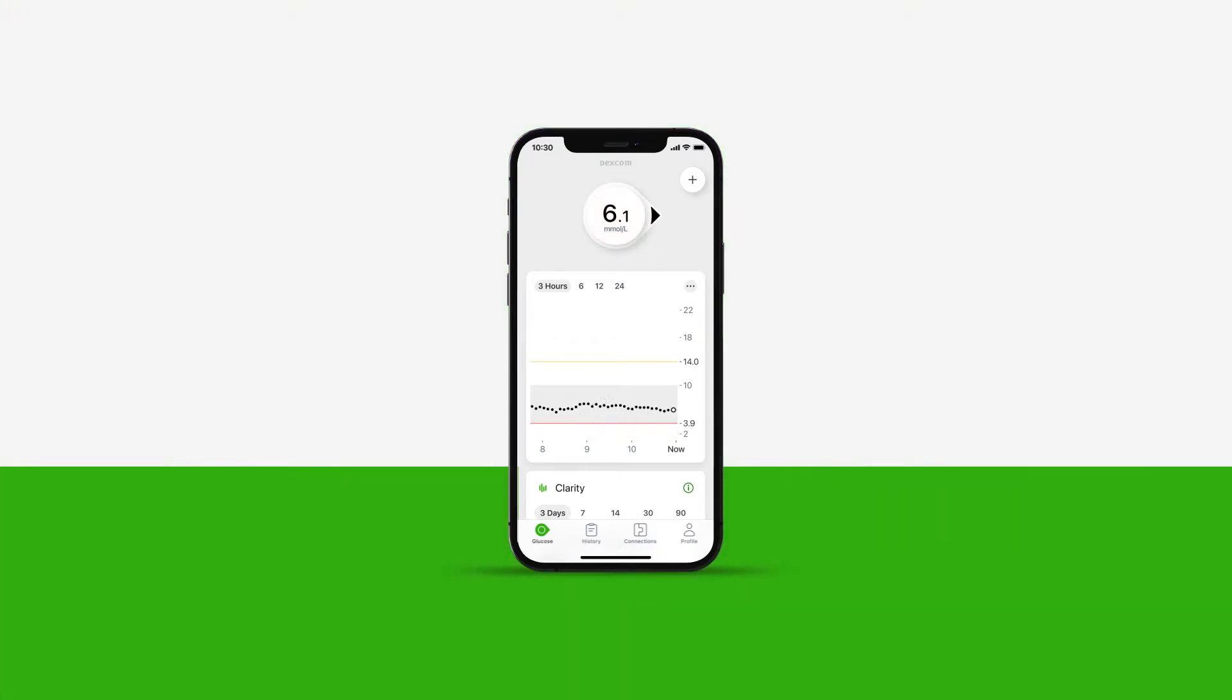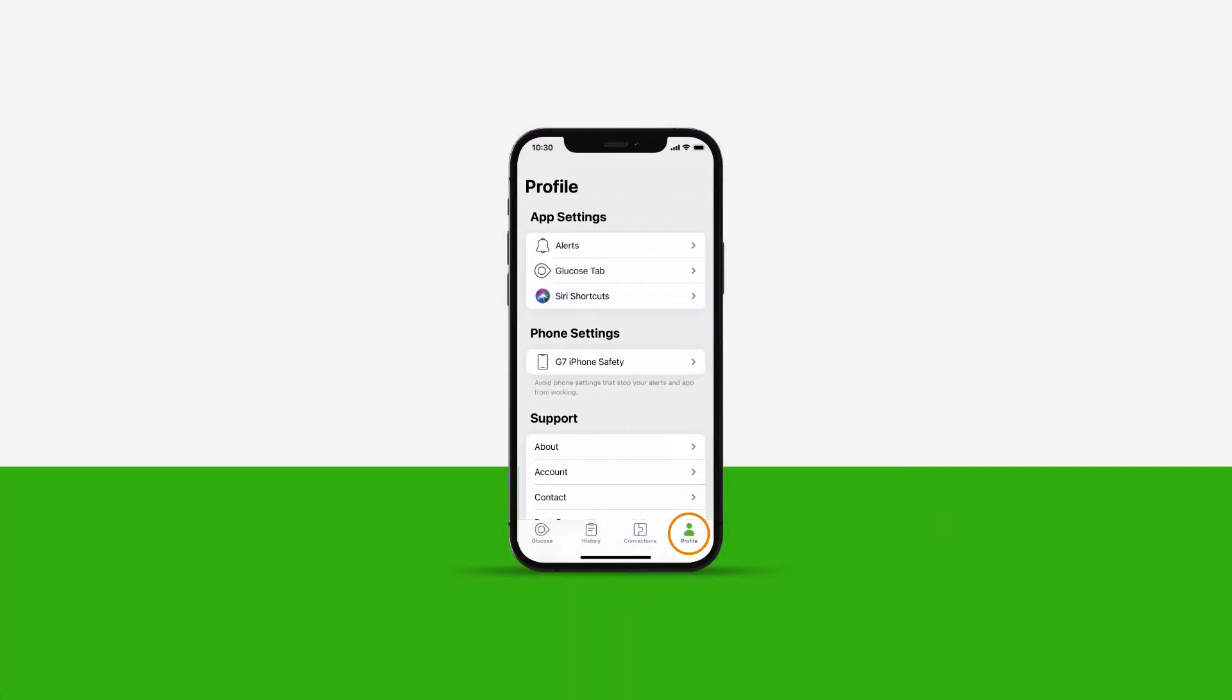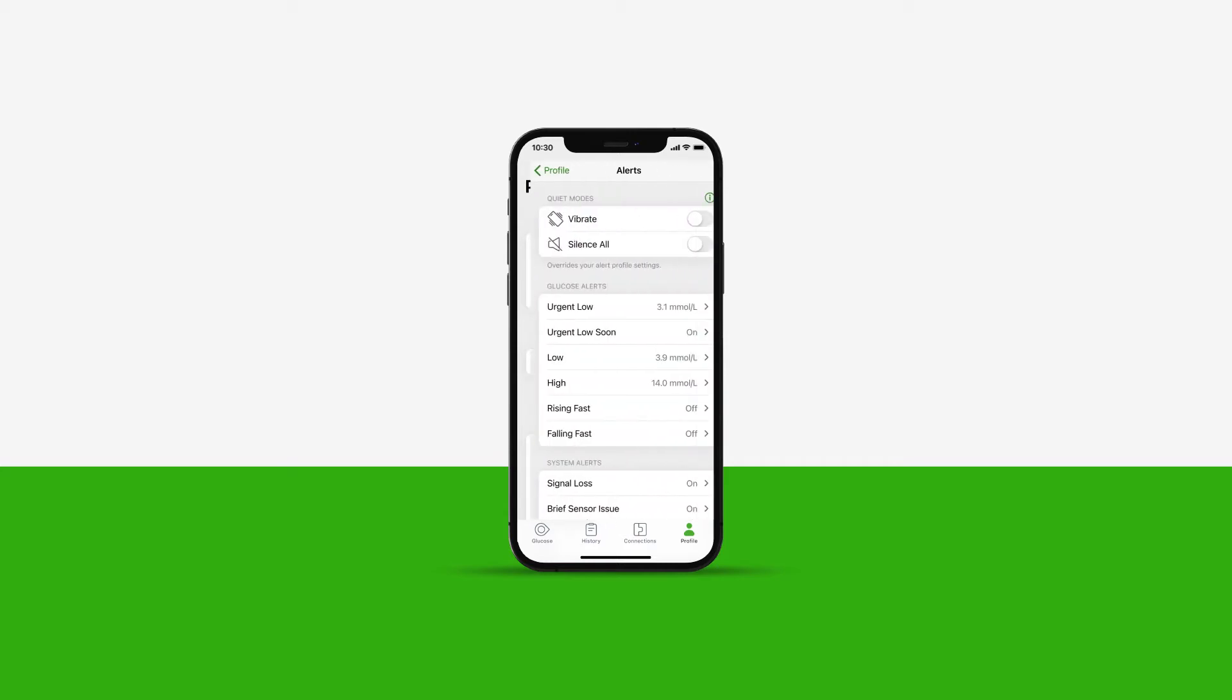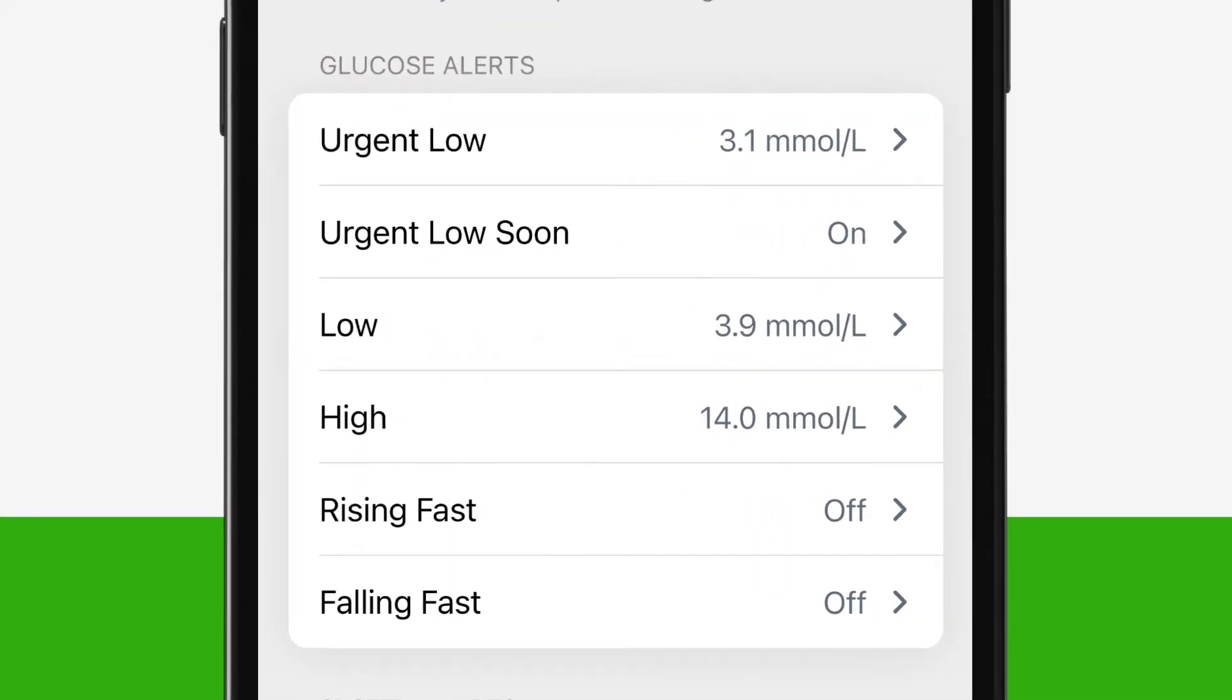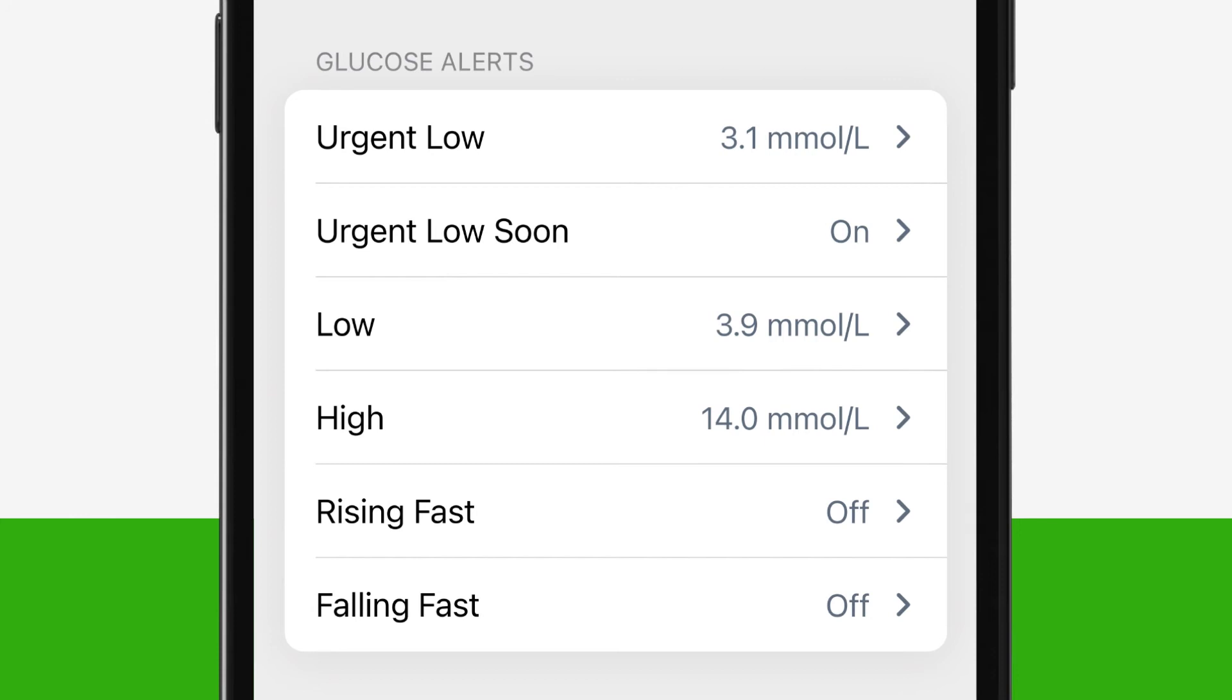To customize any alert, tap Profile in the app and then tap Alerts. In the Alerts app setting, under glucose alerts, you will see you have six options. Let's walk through each alert and how you can customize them.